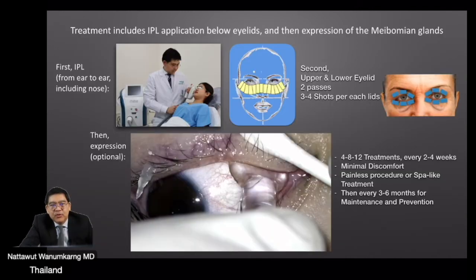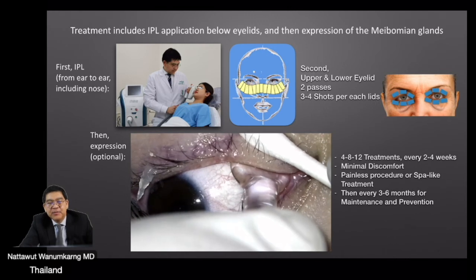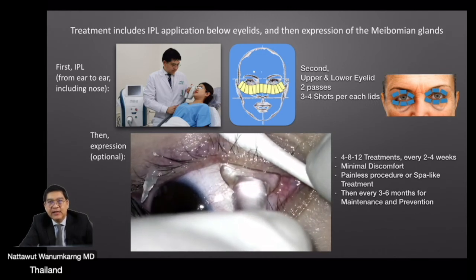For the IPL treatment protocol that I currently use in my practice, the first setting, recommended by Dr. Toyos, is from ear to ear, including the nose. The second setting is performed on the upper and lower eyelids, including 2 passes and 3 to 4 shots per eyelid, and then eyelid expression can be done accordingly.